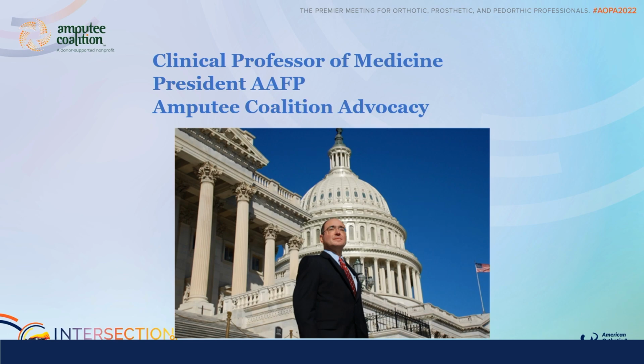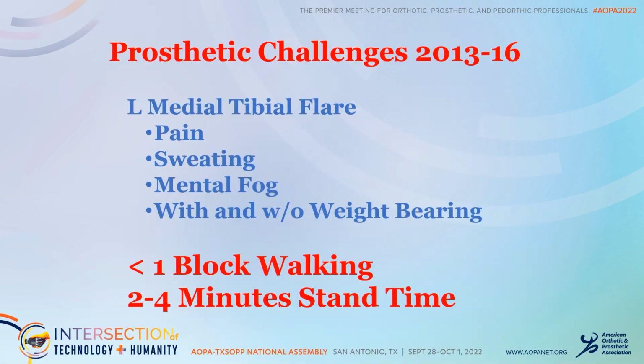Why would a guy that was doing great in sockets choose to go through this big surgery? Because I'll tell you, prosthetic sockets work great until sometimes they don't. So in my own personal case, what happened is that I had a problem on the inside flare of my tibial flare, and that pressure there and sympathetic feedback meant that I had a hard time. I was having pain and sweating that went from doing triathlons to having me able to walk or stand less than 2 to 4 minutes, walking less than a block.